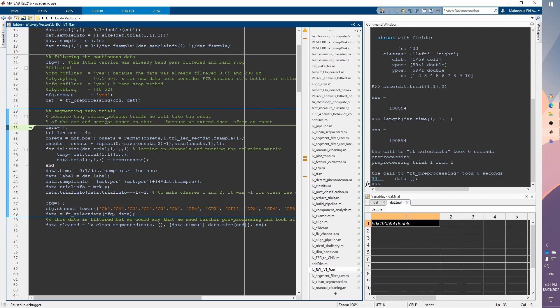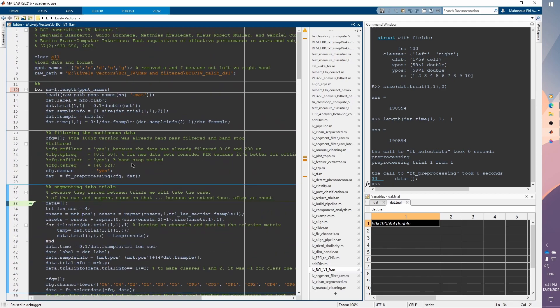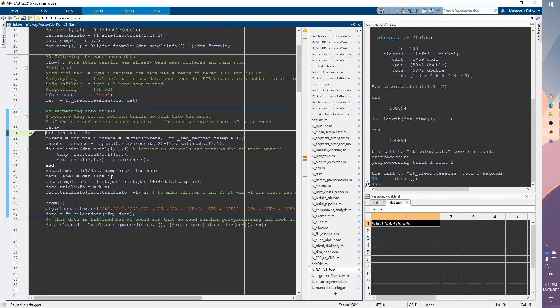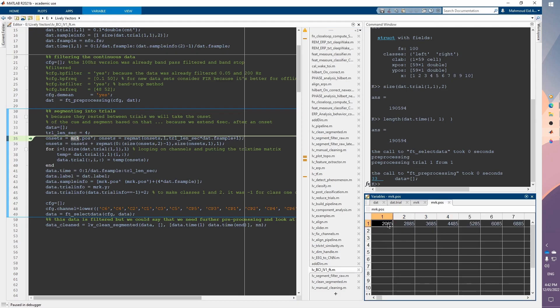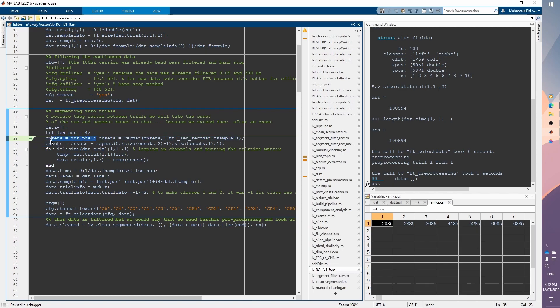What we are trying to do here is define another struct called 'data', setting the trial length to four seconds. I'm accessing mark.pos, which is the position of the markers — each one representing the sample at which a marker was presented. So at that particular sample in time a marker occurred. We need to cut four seconds after each of these samples. I'm defining something called 'onsets', which takes these positions and puts them as columns.